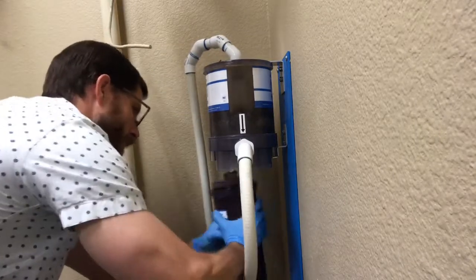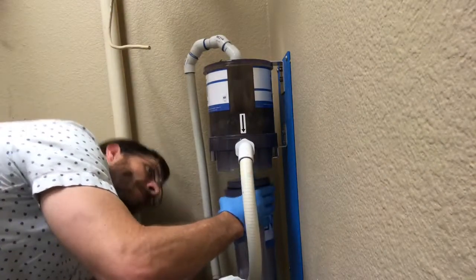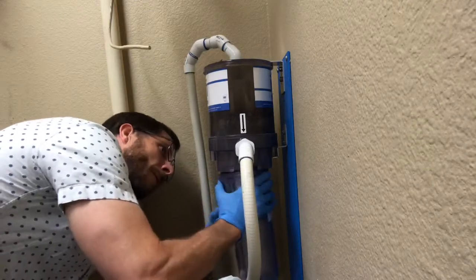From there you're going to go ahead and pull down on the old collection canister and replace it with the new collection canister. As you can see, you do not have to turn off your suction to do this.